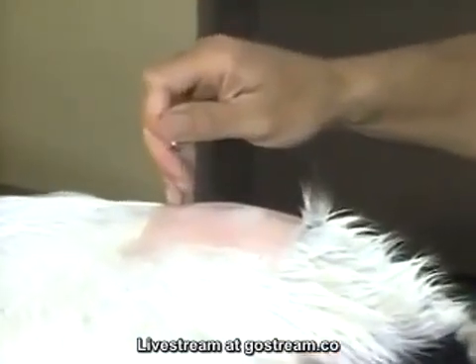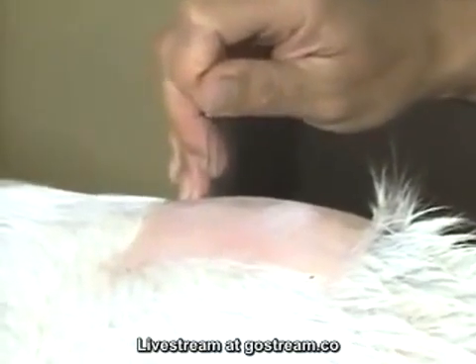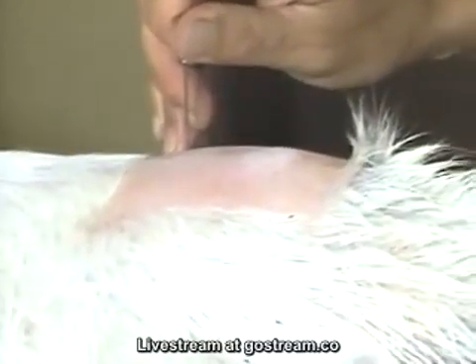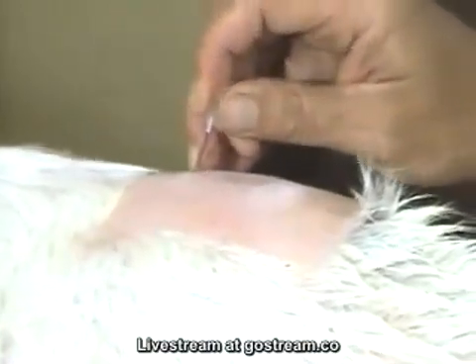Keep the bevel of the needle either directly anterior or directly posterior. The needle goes in nearly perpendicular but maybe slightly anterior-directed, precisely on the midline — then thrust it in. Most cattle make a slight movement at that point.